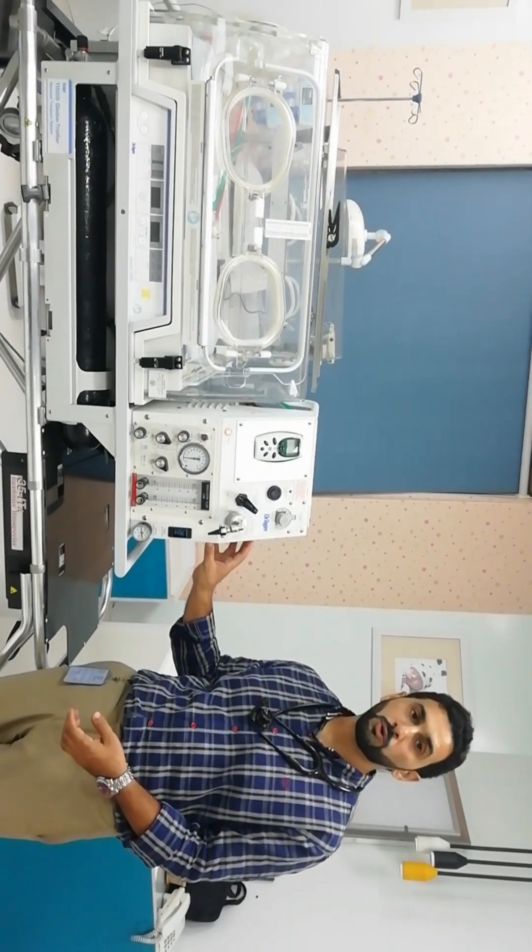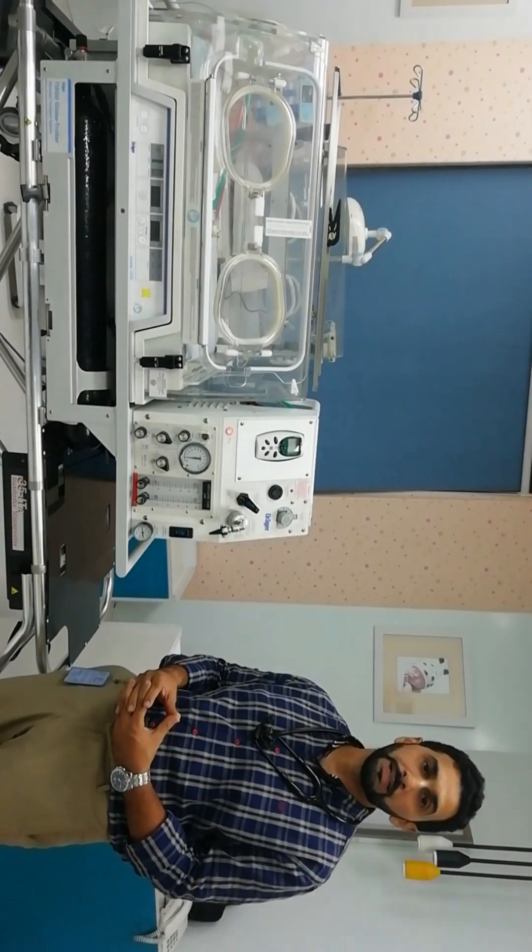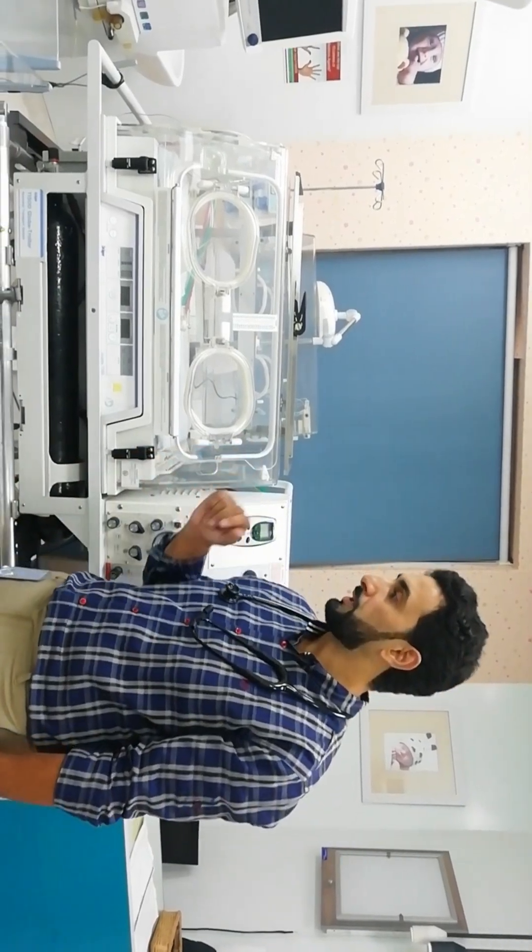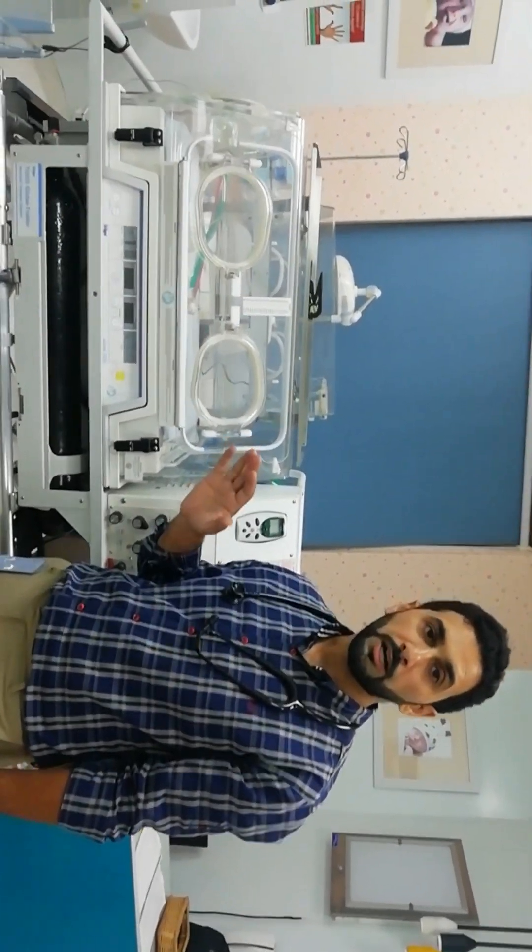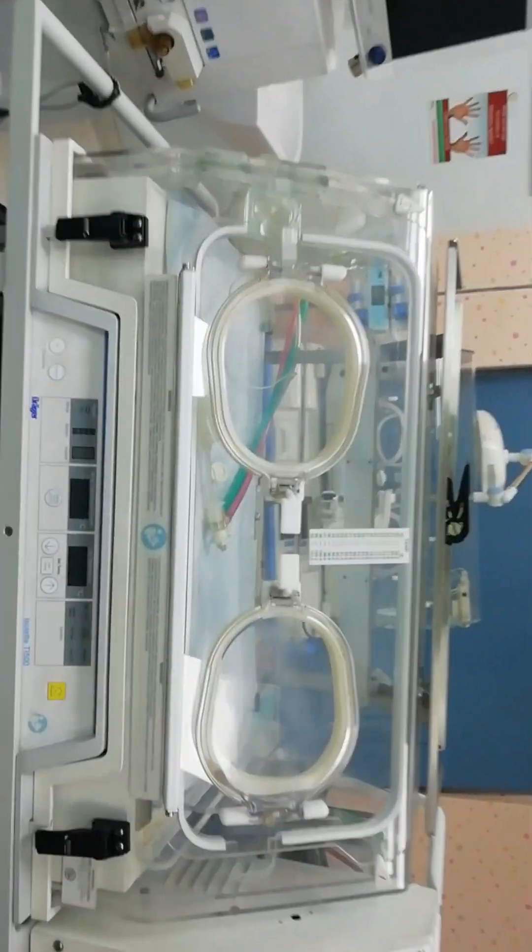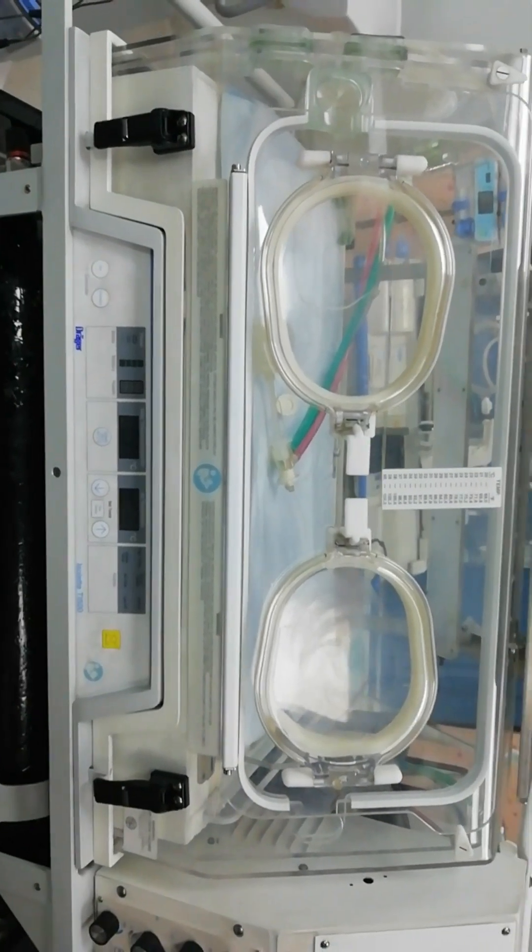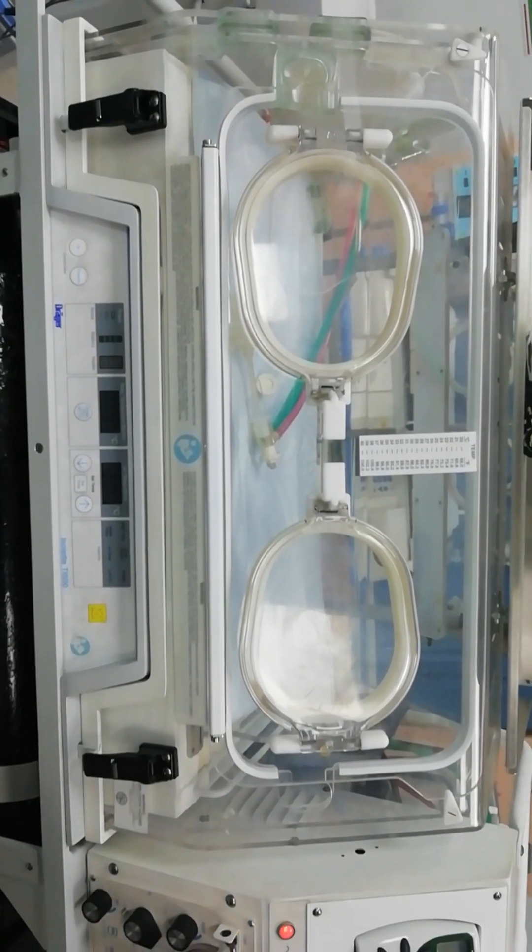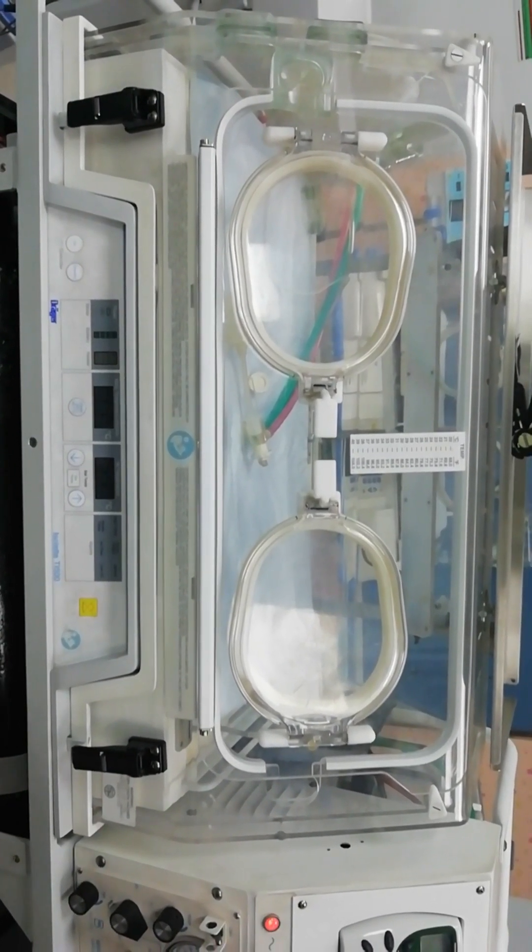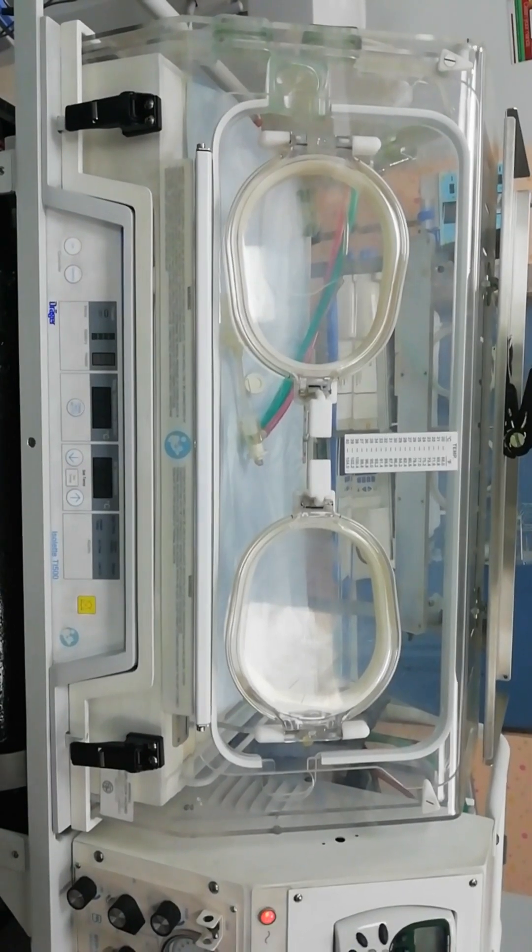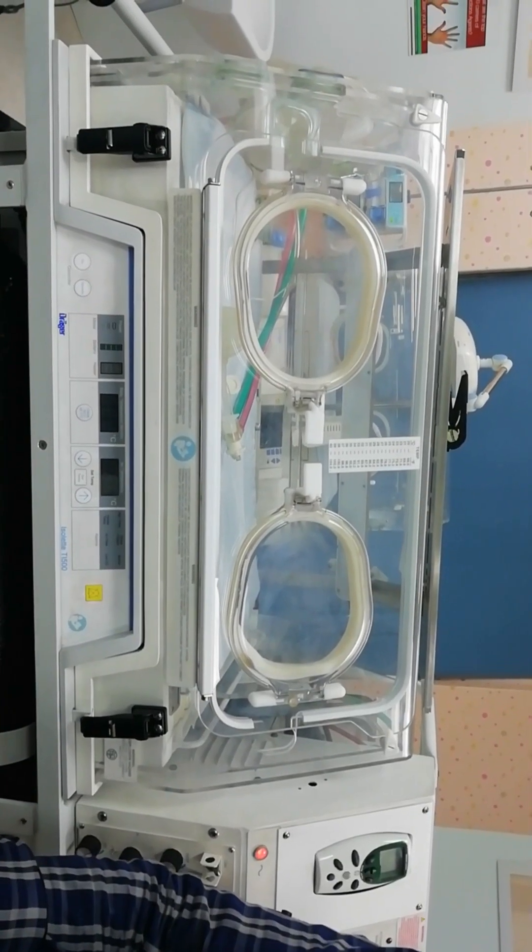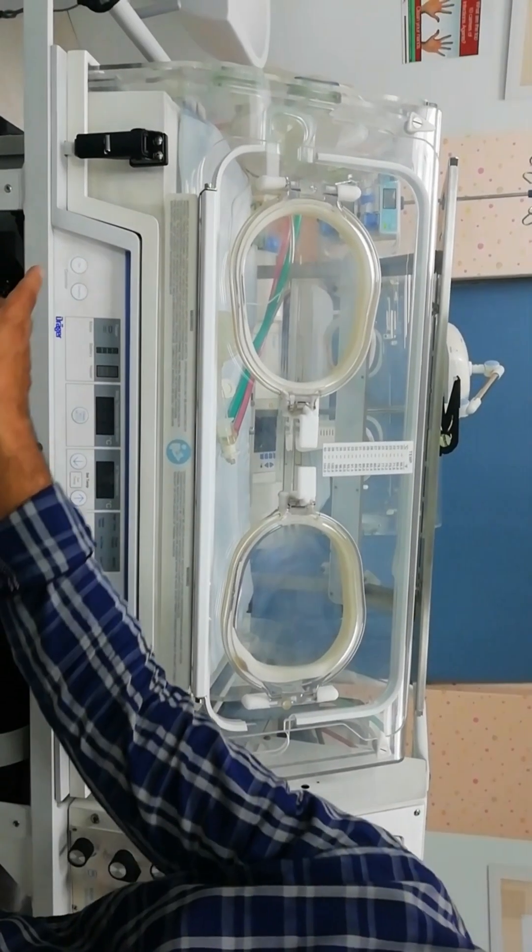Now let's start operating the system. We start by pre-warming our transport incubator, but we have to first make sure that our system is plugged in so that we don't utilize the battery that would help us during our transport. We will switch on the transport incubator by pressing the on button.